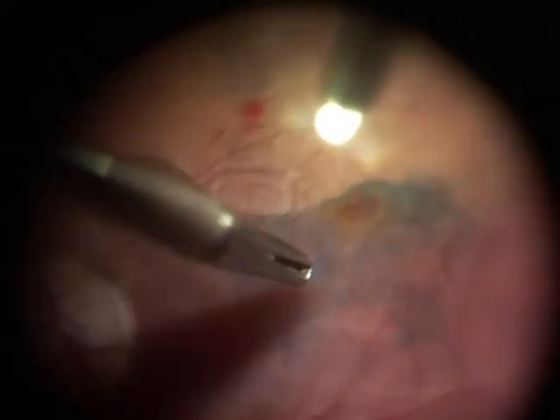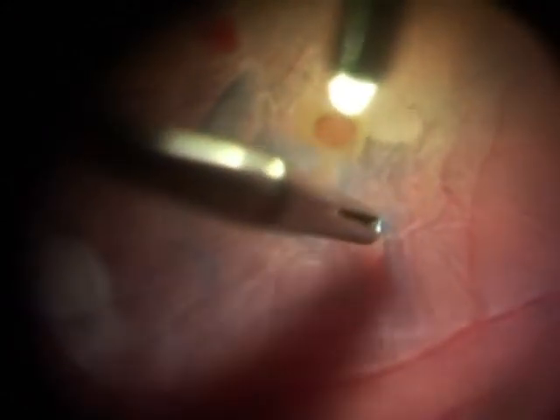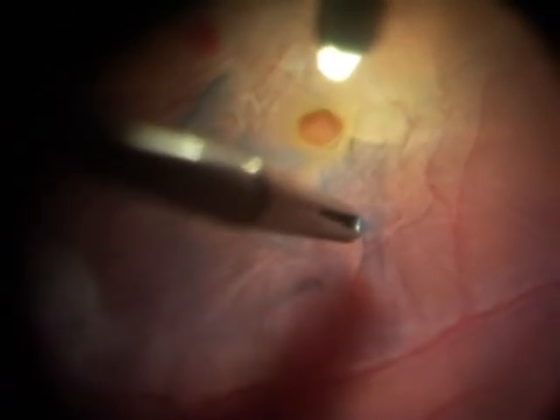After staining of the retinal surface, we confirm that neither epiretinal membrane nor ILM are present in the center of the fovea. During combined removal of epiretinal and ILM complex, we see this hole in the tissue, and we see the margin of the ILM around the non-full thickness fovea defect.